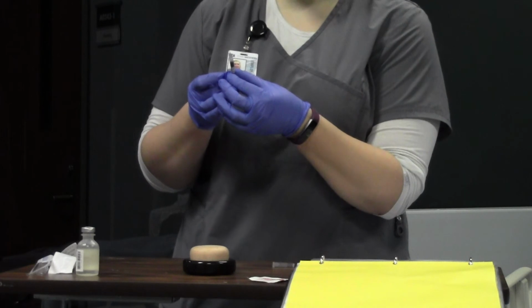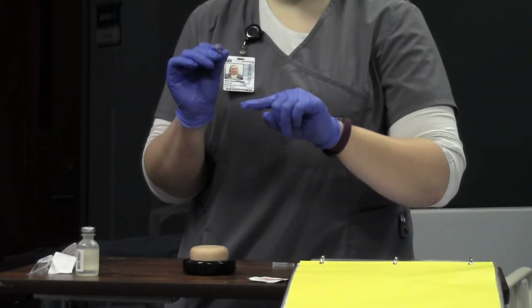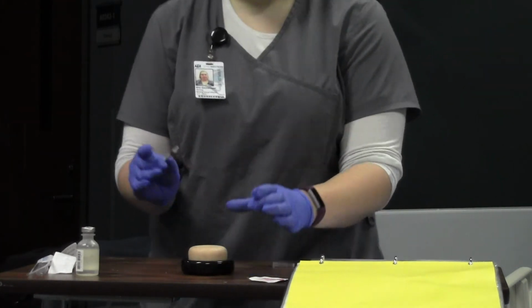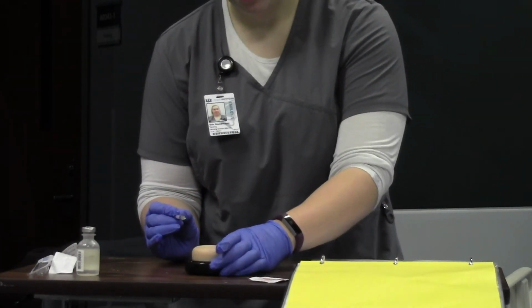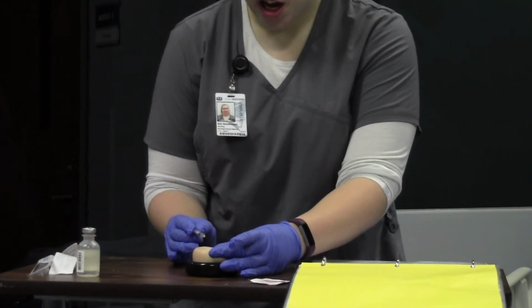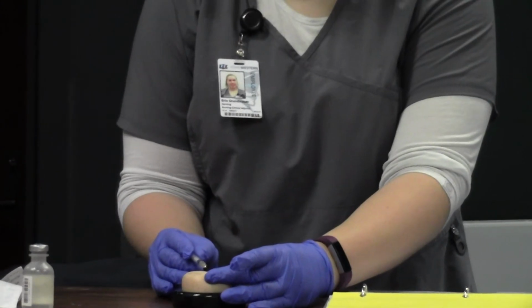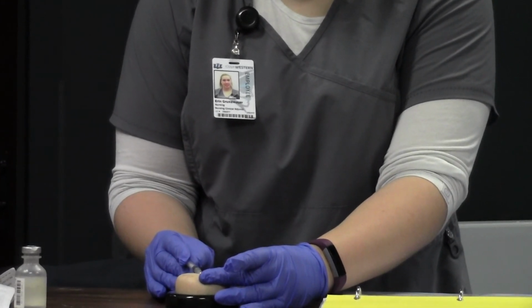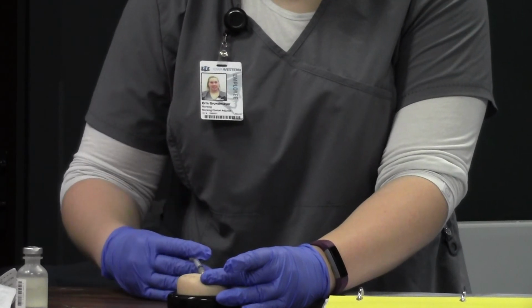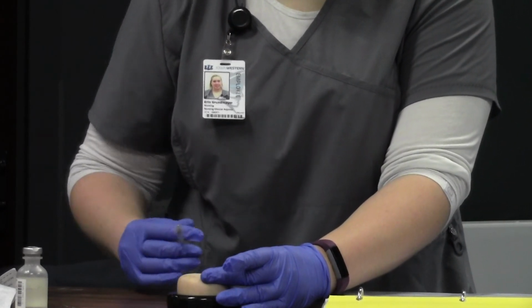I'm going to then take the needle with the bevel up, so you'll see the little slant, or you'll see the opening of the needle. I'm going to hold my needle like a dart. I'm going to hold the skin tight. And when I do my intradermal injection, you're going in at a 5-degree angle. So you're just going to skim right along your patient's skin, right underneath. And you're going to inject and pull out.